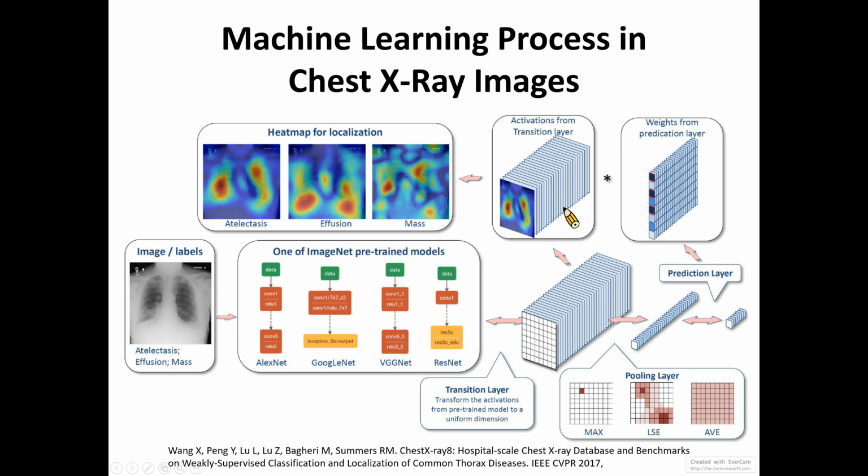The original training and testing data are very large, so I randomly selected a subset of the data from this challenge, containing only 1,000 cases with pneumonia versus 1,000 without pneumonia. I need to emphasize that images without pneumonia don't necessarily mean there were no other findings, just that there was no pneumonia in that chest X-ray image.